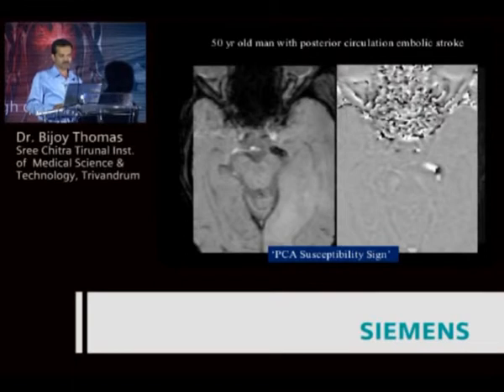So you should always look at the phase, your SWI imaging, as well as your magnitude image. If you look at only the magnitude image, you probably may miss it, although the vessel size is actually blooming out here, so you probably won't miss that.